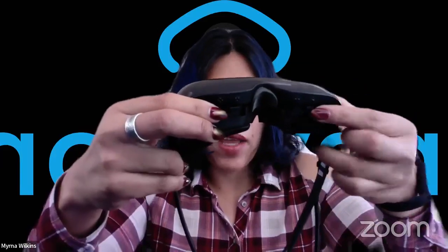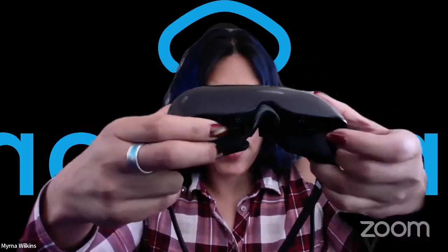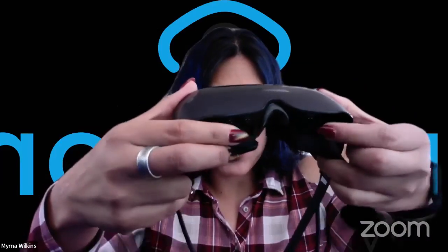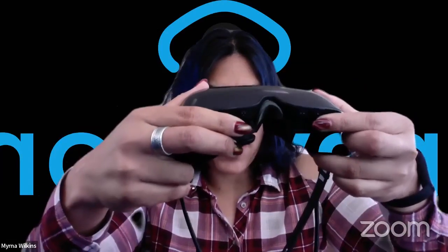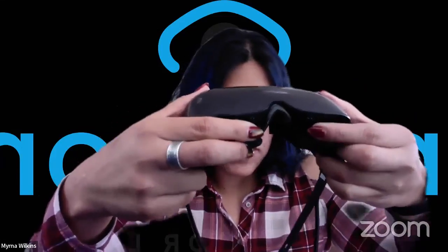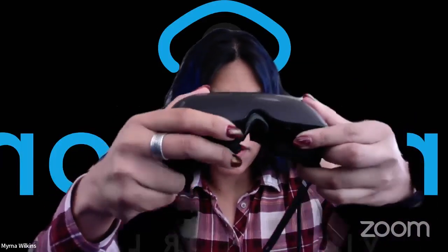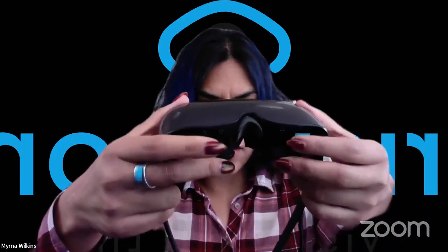Buttons three and four typically do magnification. The cool thing about Inspire is that you can actually focus each individual eye with the little focus dials at the bottom. That's great for those of us who have one eye that works better than the other. With IrisVision Live you have single clarity, and with IrisVision Inspire you have focus for each individual eye.